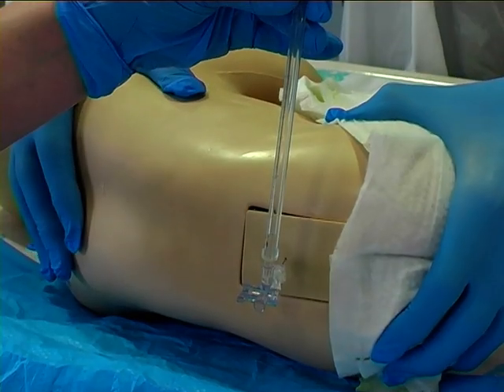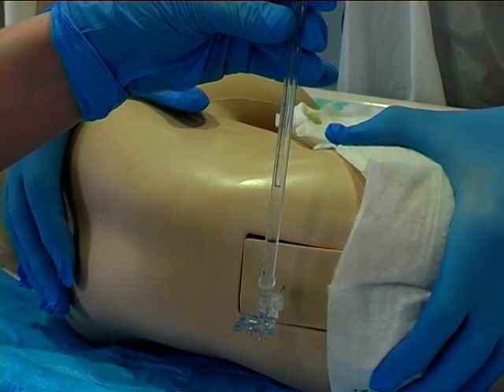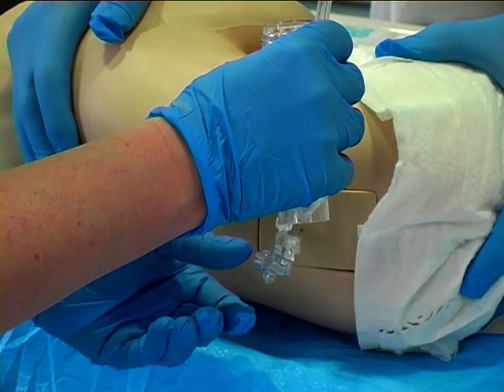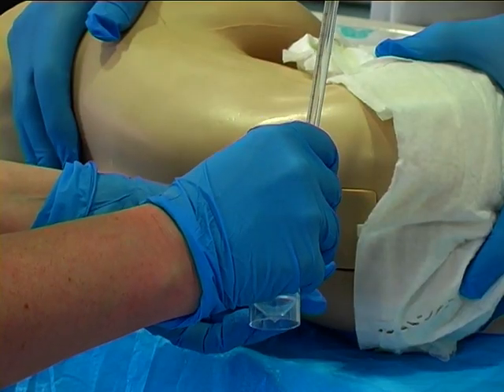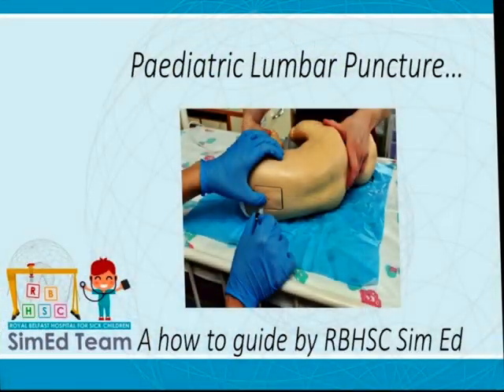Allow time for the CSF sample to gather in the manometer and appropriately measure the opening pressure when this has stopped. Following measurement of your opening pressure, you can then adjust your three-way tap to collect the CSF sample in a universal container below. Following this, turn it off, disconnect the manometer, reinsert the stylet and remove the lumbar puncture needle as demonstrated before.